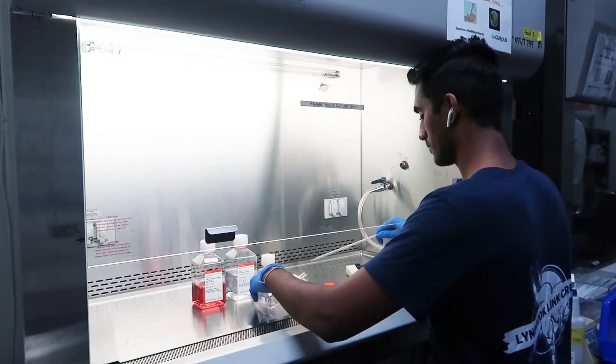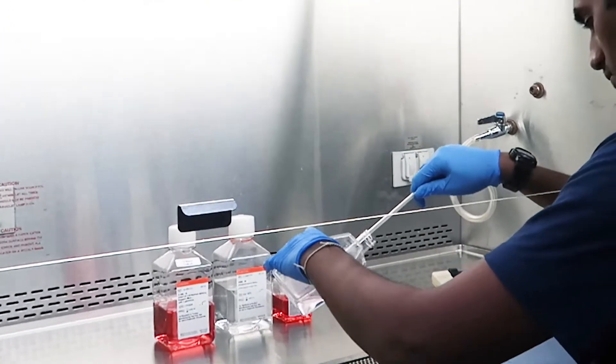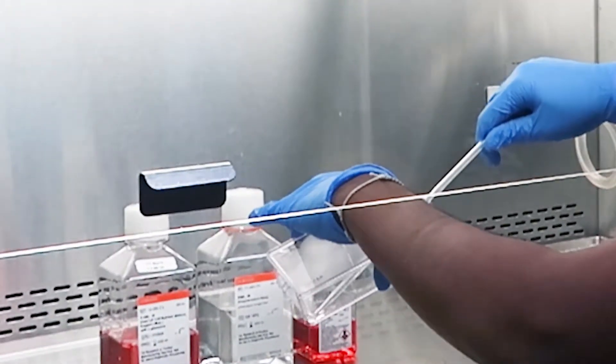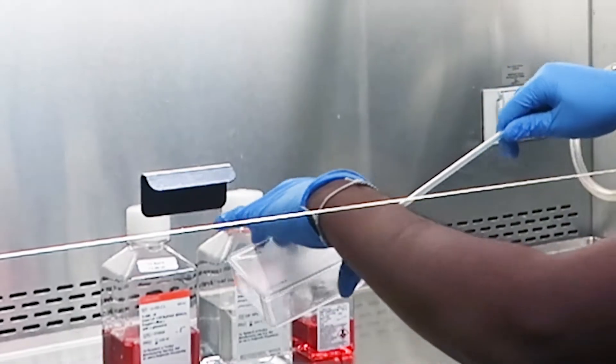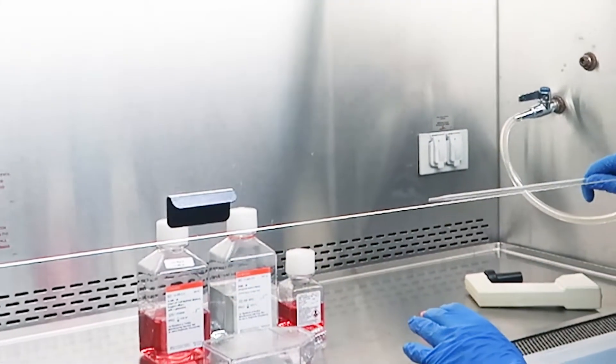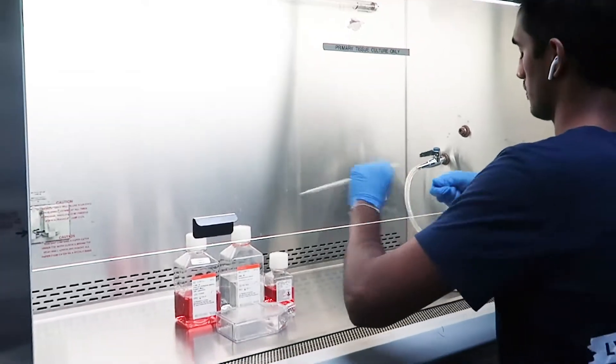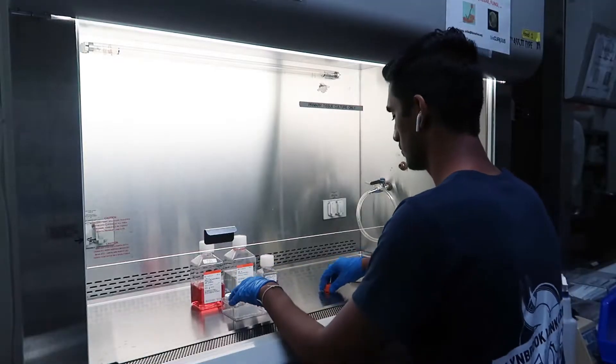Make sure that your flask is tilted once again, because you don't want your aspiration pipette to touch the cells. Once you do this, you should have a flask with only cells adhered to the bottom.